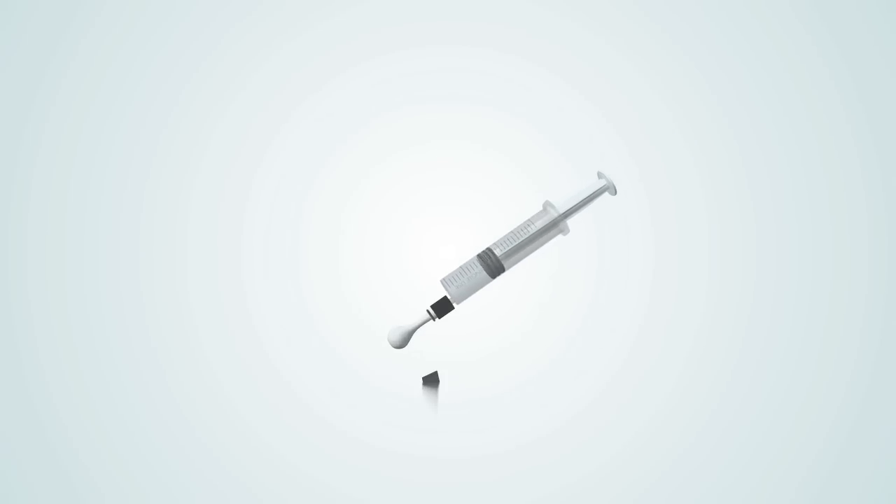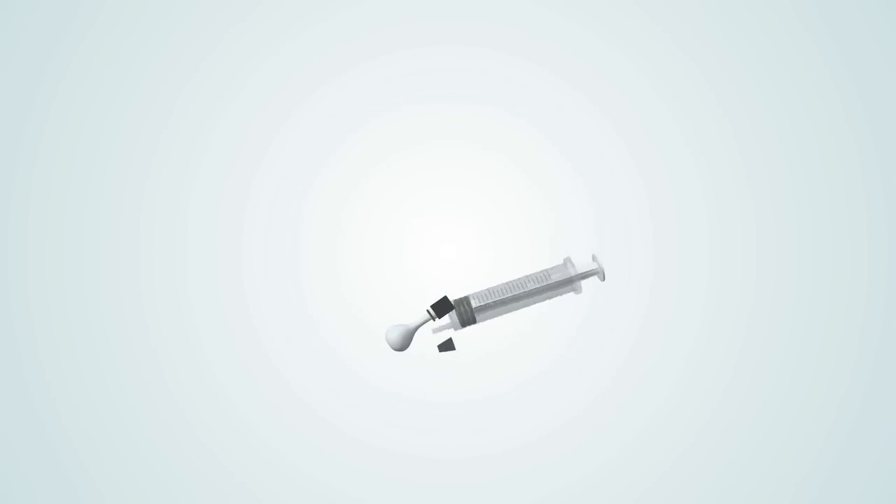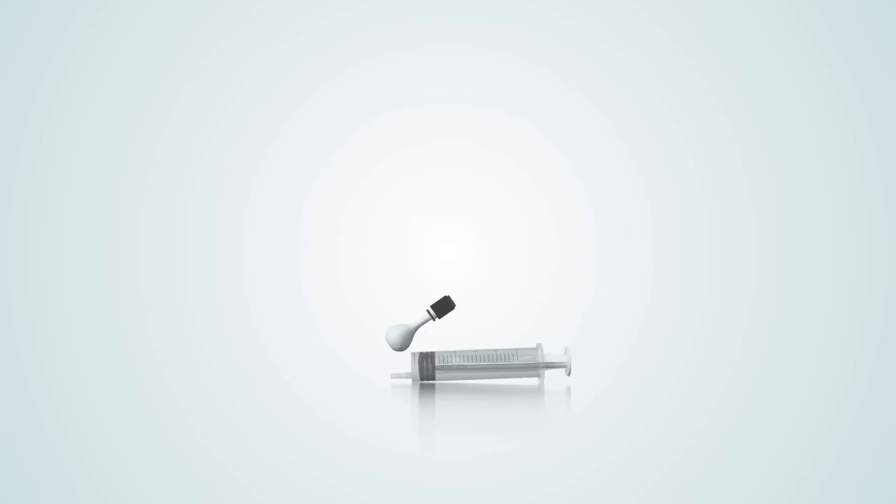Push the plunger all the way in to blow up the balloon. Twist the plunger three times while holding the neck of the balloon. Then, while holding the neck of the balloon and device head, pull the plunger out and insert the device plug. Let go of the balloon and it should remain inflated. Remove the plug and let the balloon deflate.